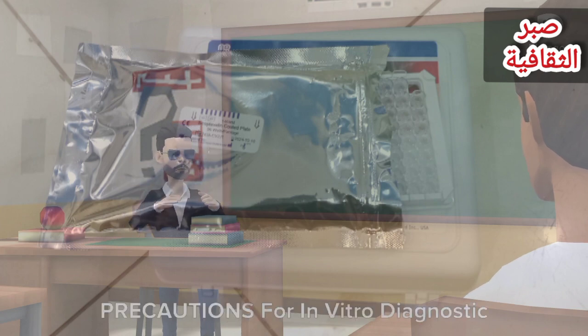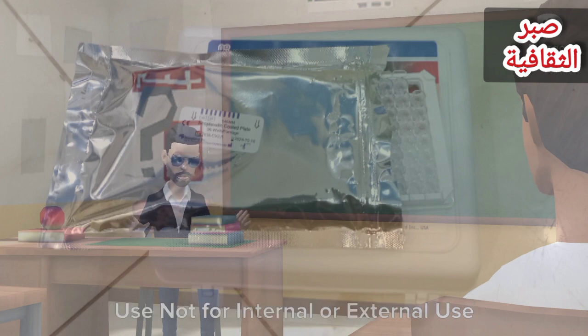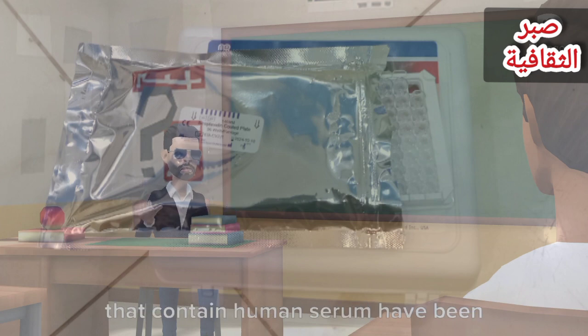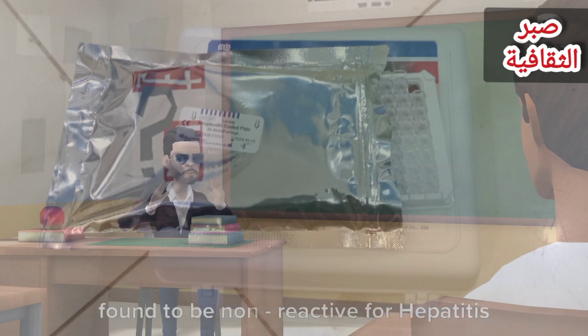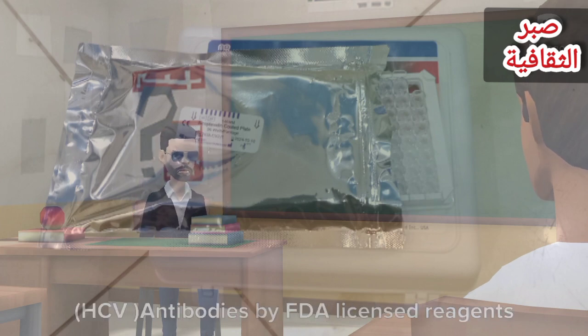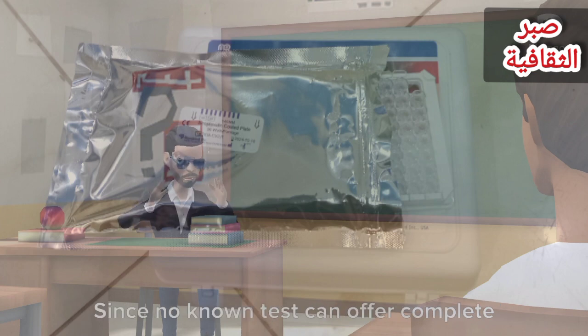5.0 Precautions. For in vitro diagnostic use. Not for internal or external use in humans or animals. All products that contain human serum have been found to be non-reactive for hepatitis B surface antigen, HIV 1 and 2, and HCV antibodies by FDA-licensed reagents.